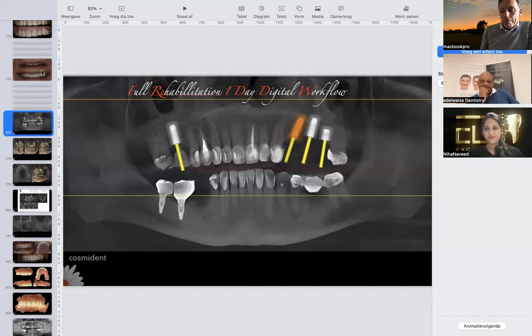Then you put the patient in an articulator, with the splint as if he's been wearing it for a few weeks or months, and put it back into articulation. Once it's done, you have the raised bite, and you can add material however you want. Then you're sure that everything is right because you checked it.